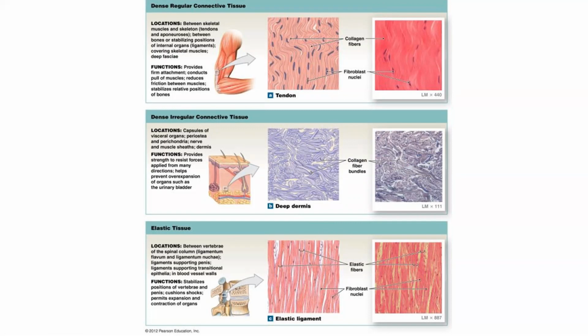Another type of connective tissue is considered elastic tissue, and that is what we see here. Now, this is a very zoomed up version of elastic tissue. On many slides, it looks more like dark, seemingly short strands packed tightly with one another. So I highly encourage you to reference your textbooks or another reliable source to look for other examples so that you're not surprised on a quiz or exam with how that may appear.